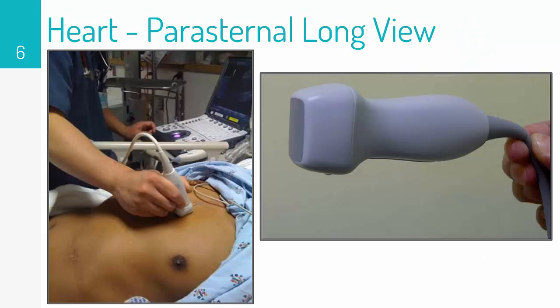So this is our parasternal long axis setup. You're going to obtain this view by placing the phased array or cardiac probe at the 3rd or 4th intercostal space to the left of the sternum, perpendicular to the patient's chest. Unlike other bedside ultrasound exams, the probe indicator should be aimed at the patient's left hip. If you're struggling to get your view, make small adjustments in the placement and angle of the probe. Rib shadowing is often bothersome, but can be overcome with some adjustments.